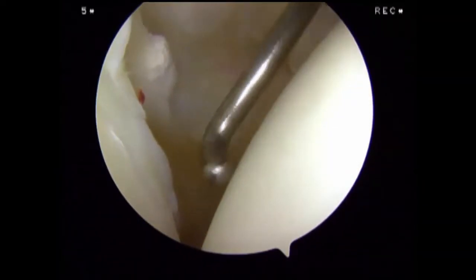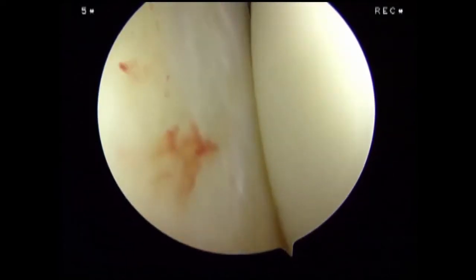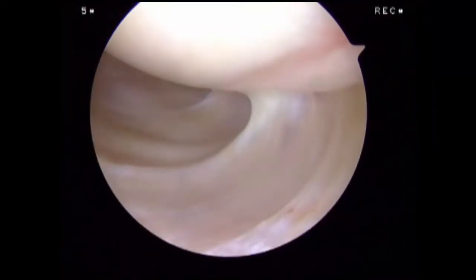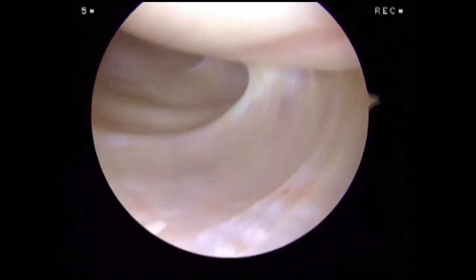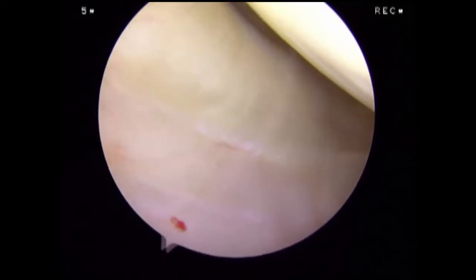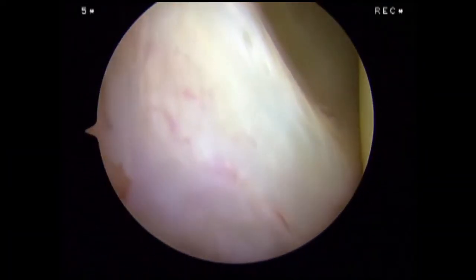We visualize the inferior glenohumeral ligament, seen here with the probe. We then rotate inferiorly and posteriorly to visualize the posterior recess. Beginning at the inferior aspect of the labrum, we advance the arthroscope superiorly to assess the entire posterior labrum.